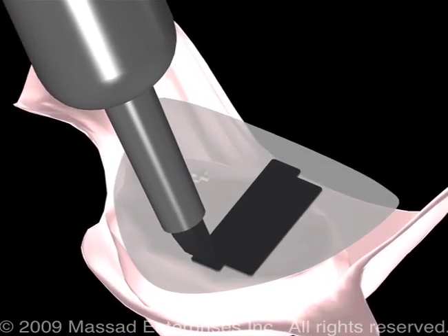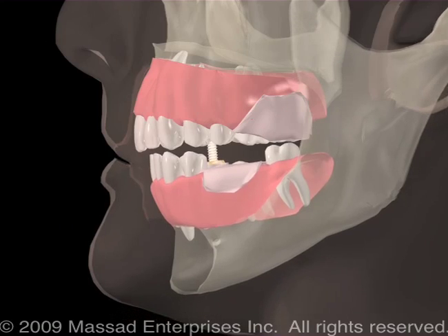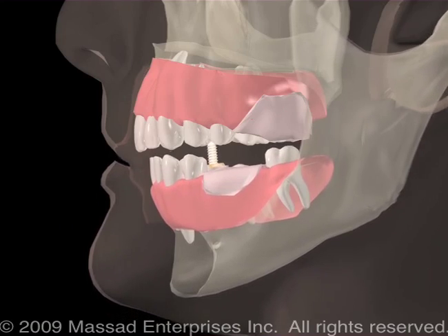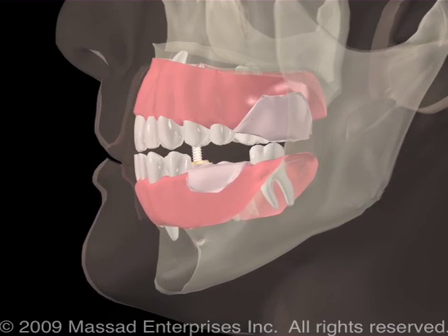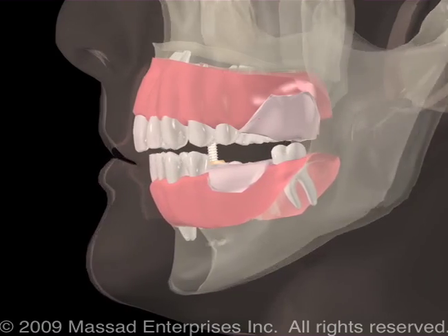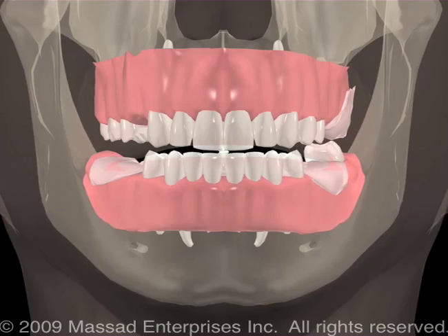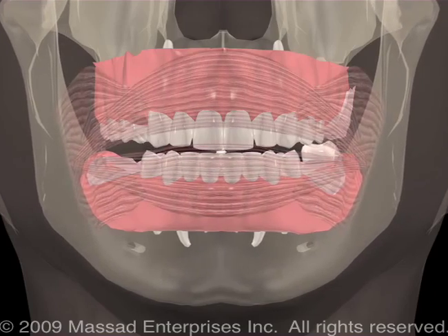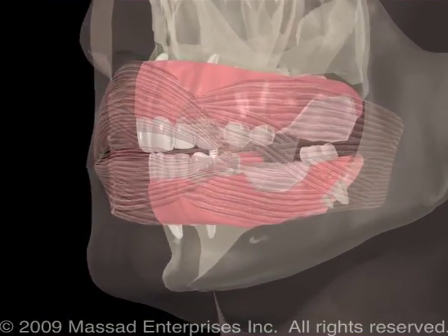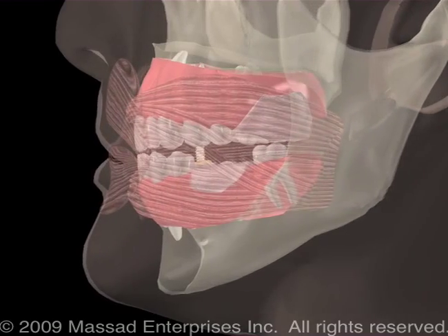Now place ink onto the sliding plate. Have the patient tap to be assured that the bases are seated without rocking. Have the patient slide the jaw forward, then back. Again forward, back, and then side to side. It is necessary to be able to see very smooth movement as the patient rubs forward, then back, and then side to side. Have the patient continue to do this until you are satisfied that the patient is not inhibited.